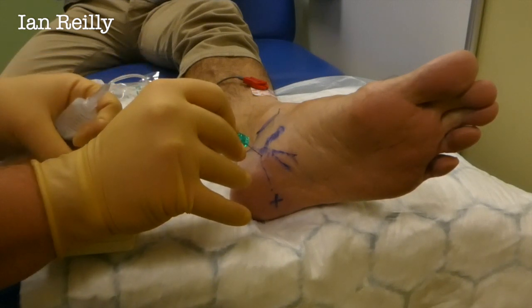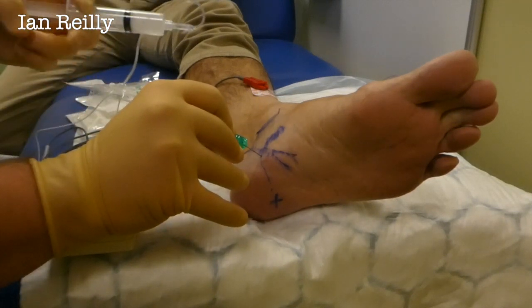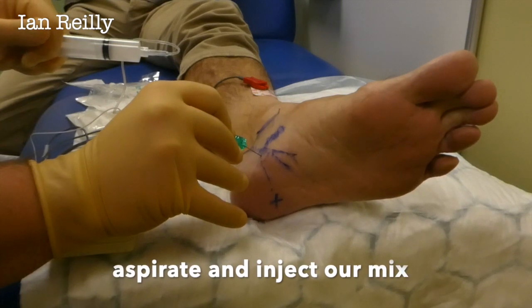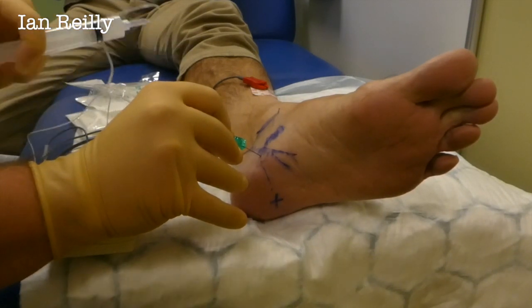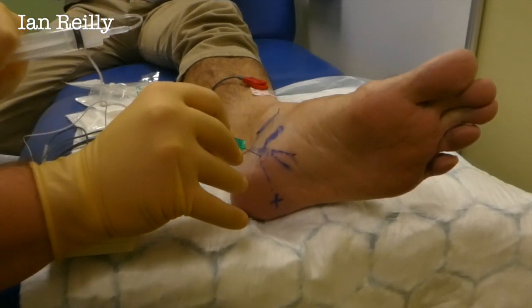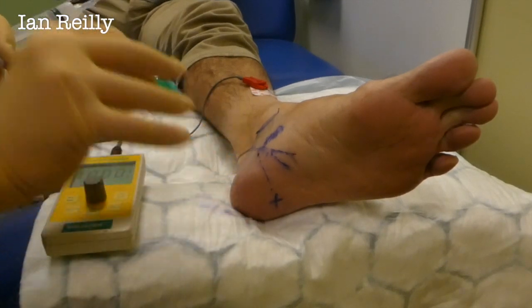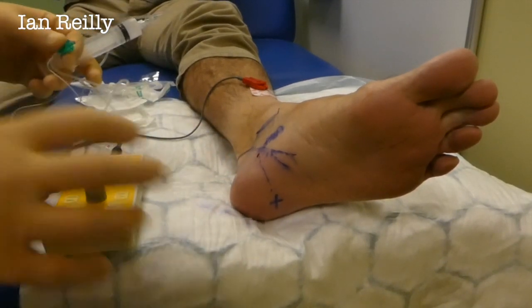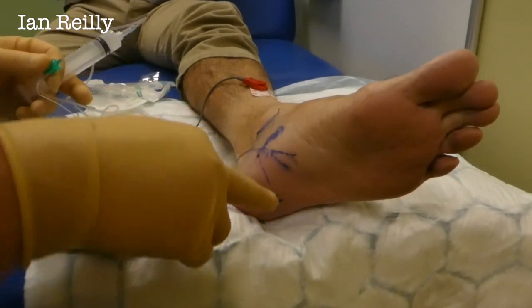We're still getting a response at 0.6. We aspirate at that point and inject — a little bit of pressure — and sometimes you'll feel it going in. Peter, you almost reproduce the symptoms. Yes, I can feel a little bit of pain across the bottom of the heel as well as you're doing that, which is a good sign. Excellent — that's the injection that's actually getting that nerve as it comes down properly.